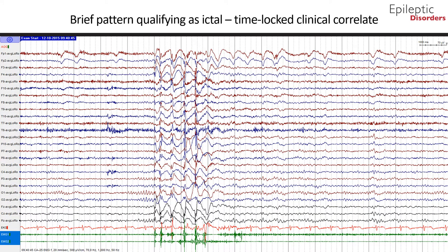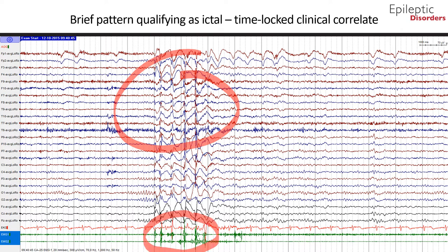The same seizure shown in average montage: you can see generalized 2 Hz spike and polyspiking wave discharges that are time-locked with myoclonic movements, consistent with a brief pattern that qualifies as ictal. Each myoclonic movement, as outlined by the EMG-1 and EMG-2 artifact, is time-locked with a spike and wave discharge.